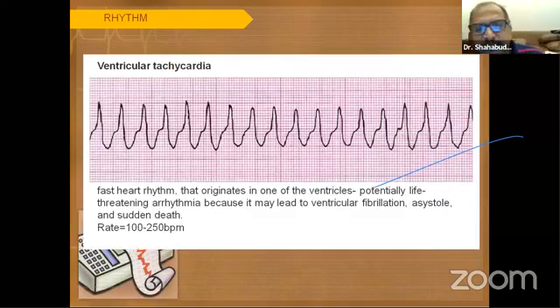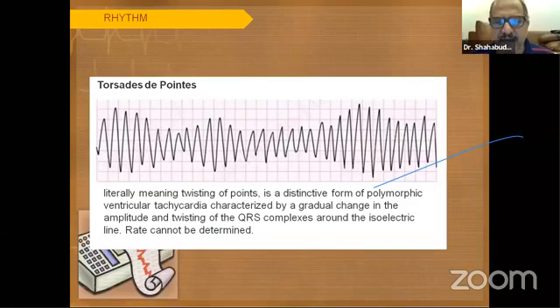And in the case of ventricular tachycardia, that is a wide complex tachycardia, mostly regular wide complex tachycardia, and the rate is mostly more than 120 beats per minute. With PVCs, three or more in consecutive states, we can call it ventricular tachycardia. If it is present, it should be managed acutely in an emergency if it is associated with shock. If there is no shock, it can be managed medically.